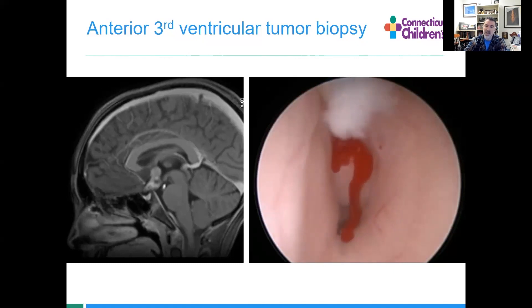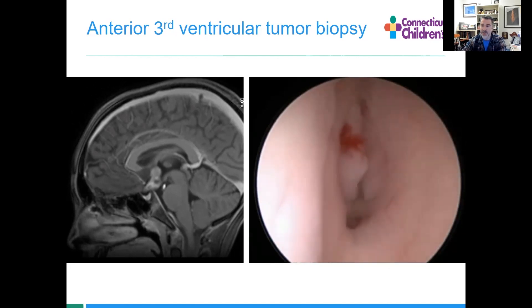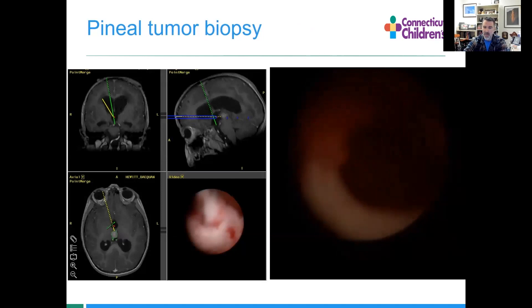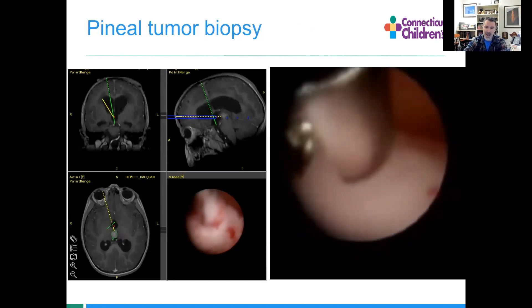You get small specimens, but you get appropriate specimen for a diagnosis. That's a very small amount of blood — you can see a lot more than that in ventriculoscopy and you just irrigate your way out of it. There are also times where we go back to the pineal region via a low frontal trajectory. The concept is the same going up there, and you'll see a pair of grabbers working to obtain tissue.